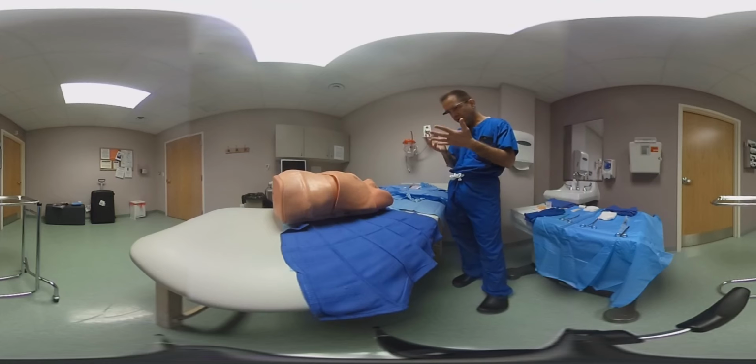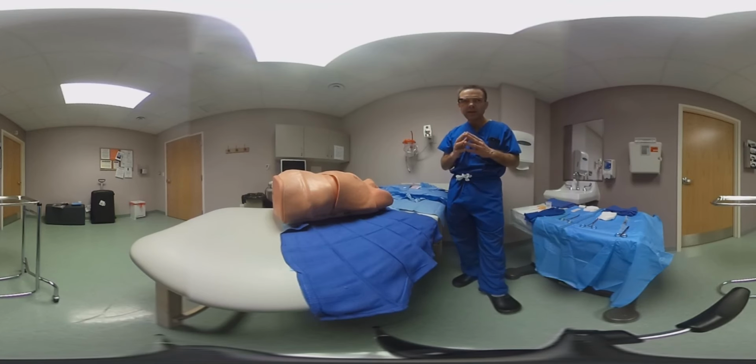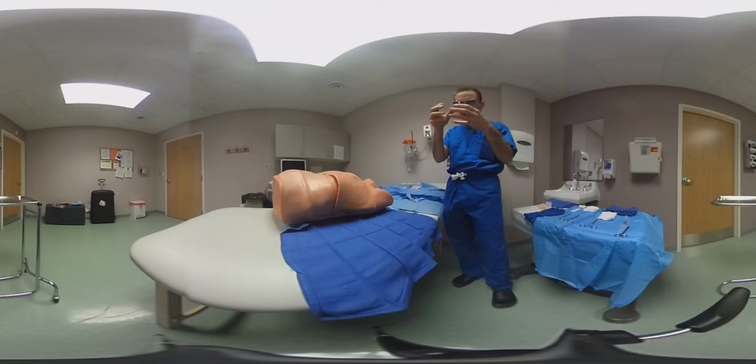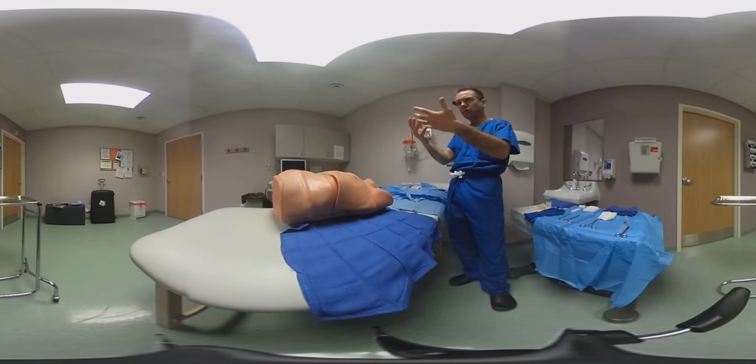I have a Google Glass which I'm using to record this procedure from the perspective of the surgeon, and also I have a Theta S camera, which is a 360 degree recording camera, which you can then manipulate on the smart device, or you can put your phone on a Google Cardboard or any other 360 degree viewer, like a VR1 or a Viewmaster, and then immerse yourself in the actual procedure, being able to view in a 360 degree spherical presence the actual procedure and transport yourself to the procedure area itself.